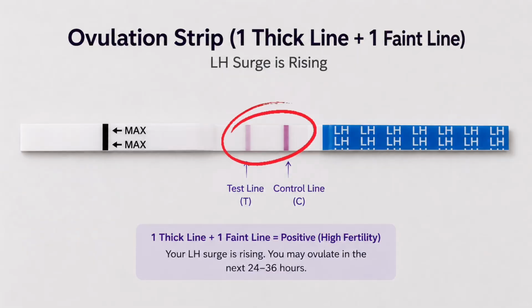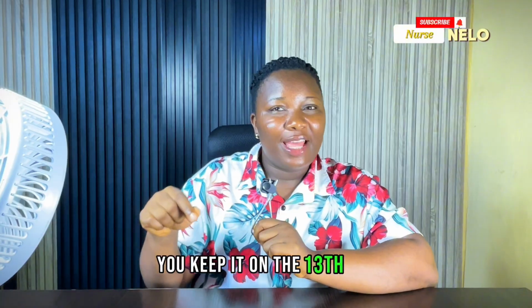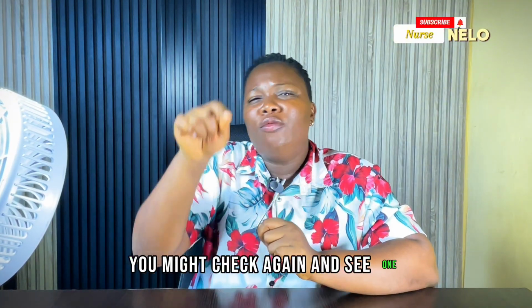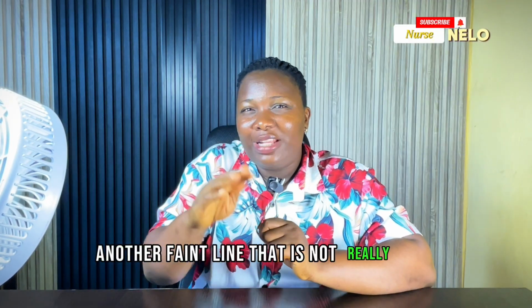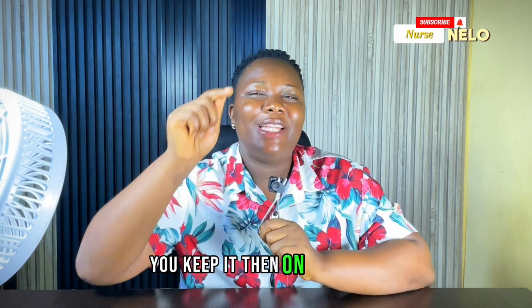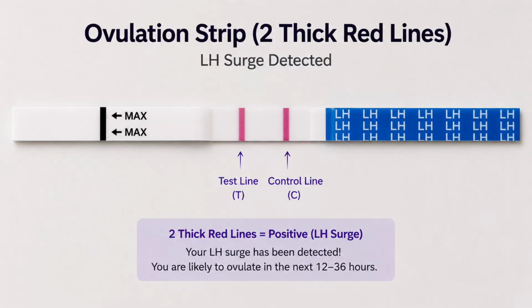You keep. On the 12th day, you test. You might get a red line and then a faint line. One full red line and then a faint line. You keep it. On the 13th day, you might check again and see one full red line and another faint line that is not really that faint. You keep it. Then on that 13th day, you try again. You test again. The possibility of having two sharp red lines is possible.